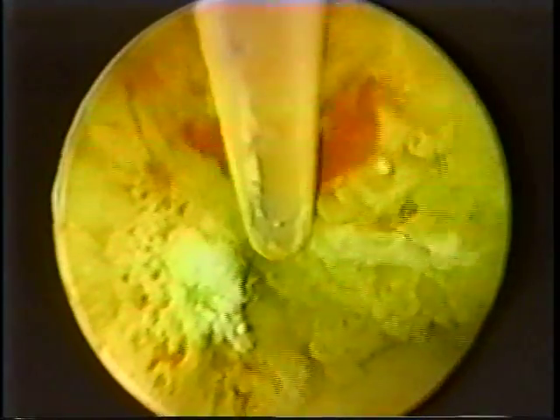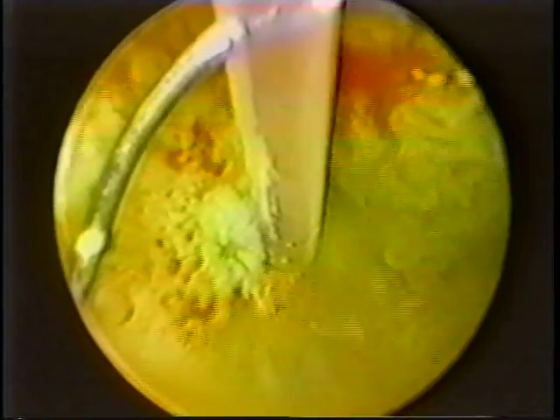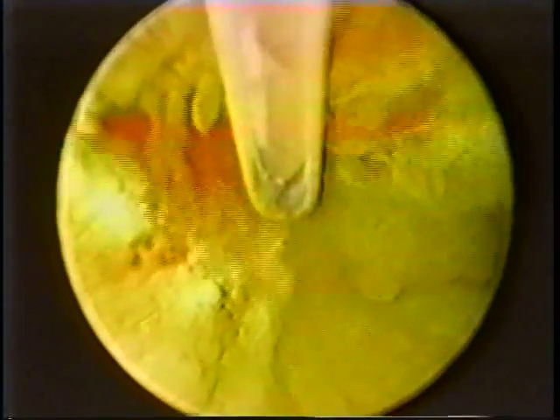When the holmium laser is used as a direct contact laser, it cuts through tissue just like a scalpel. This enables the surgeon to cut across the stalk of a papillary tumor and obtain tissue for pathological examination in a manner similar to the electrocautery resection using the cutting current.